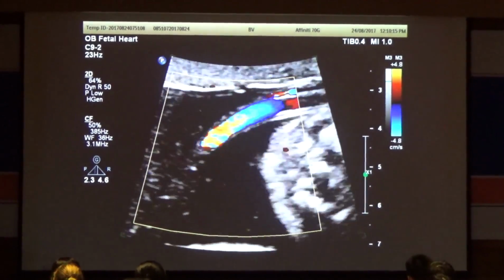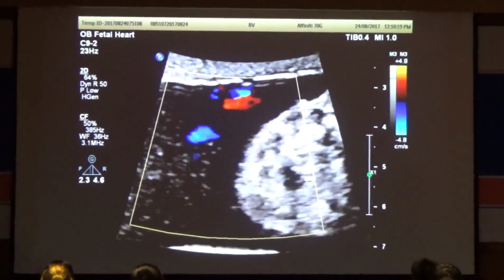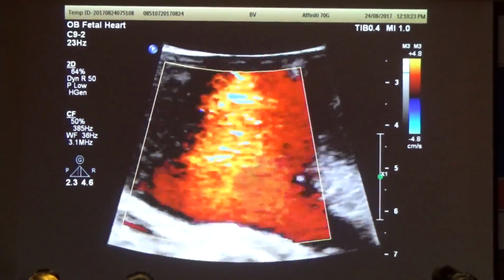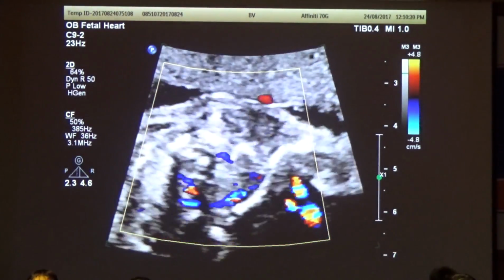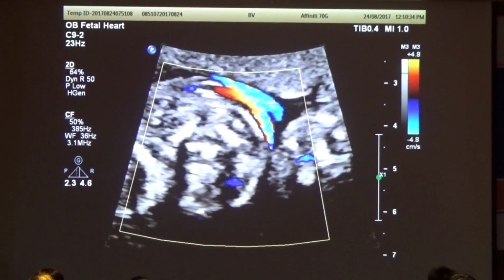Alright, now we're looking at the umbilical cord. Cuốn rốn. It looks like there are 2 vessels there, and now we just want to find out where the butt is. So the head is down, it was down a minute ago. Here's the 2 umbilical arteries.